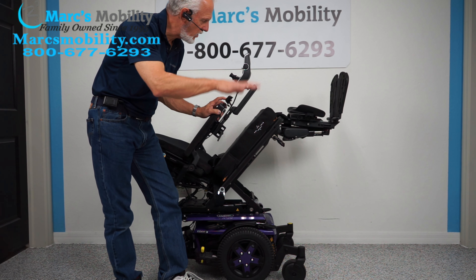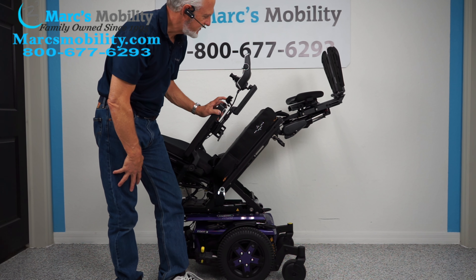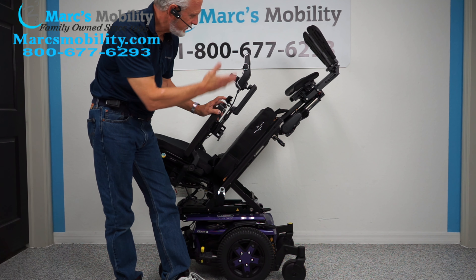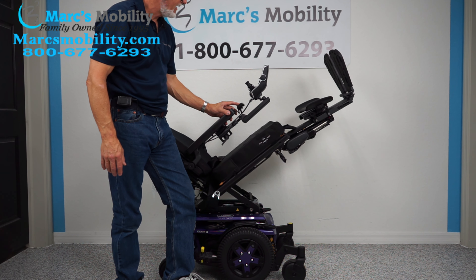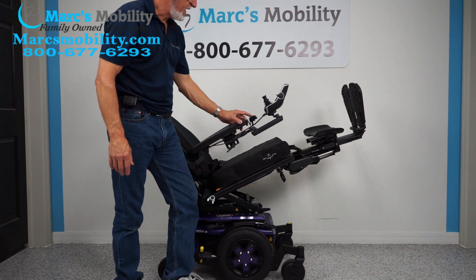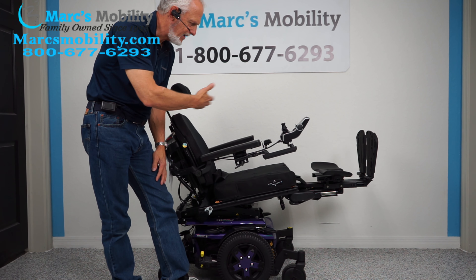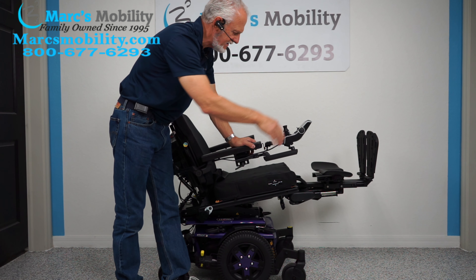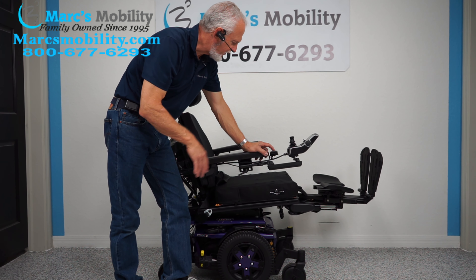The next thing I'm going to show is called the electric legs. These buttons — if you touch them once, they go up; if you touch them again, they go down. They're touch buttons. So if you needed good circulation, with your legs high up in the air like this, that's great. But you don't have to be quite this tilted back with your legs up to get good circulation — you could be halfway tilted and you can still see your legs are higher than your body. These foot plates are adjustable, so whether you're five feet tall or six foot two, we can adjust the legs to fit.